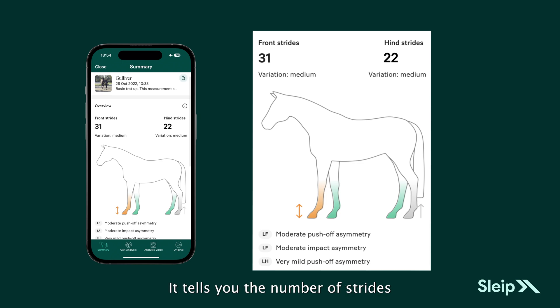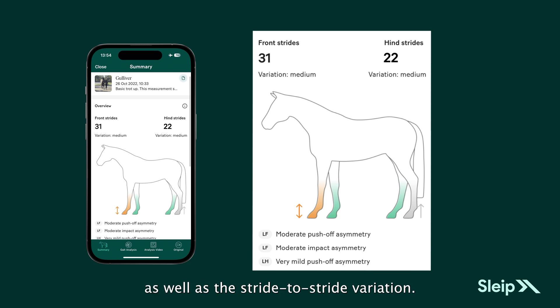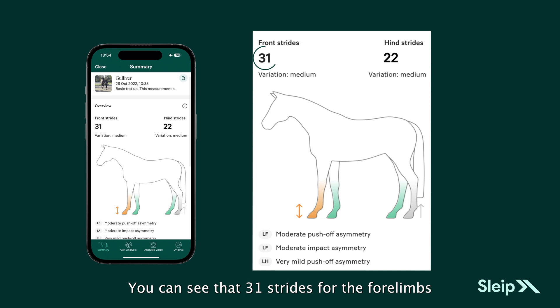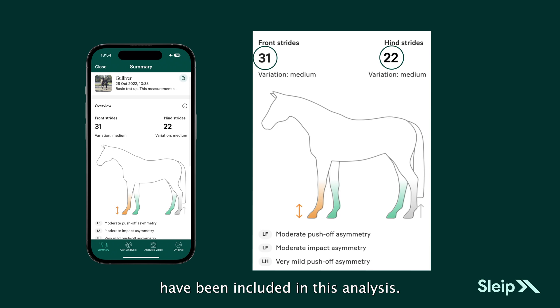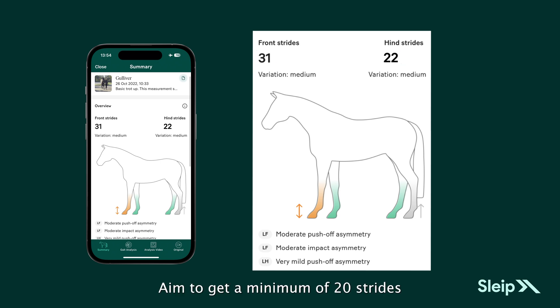It tells you the number of strides captured in your recording as well as the stride-to-stride variation. You can see that 31 strides for the forelimbs and 22 strides for the hind limbs have been included in this analysis. Aim to get a minimum of 20 strides for both fore and hind.